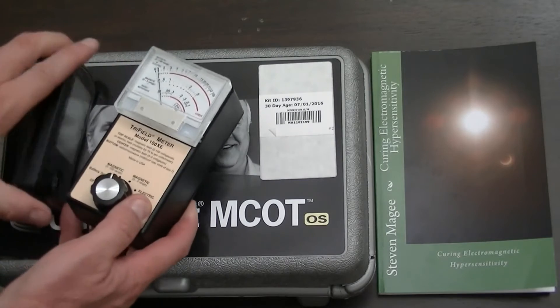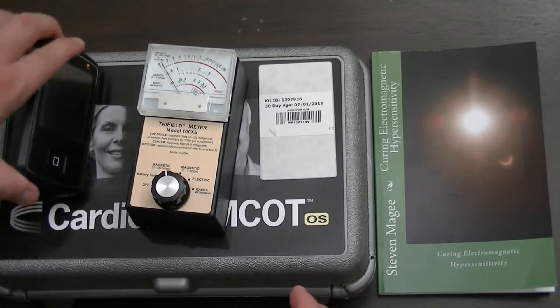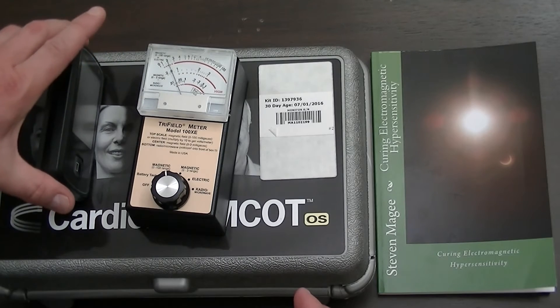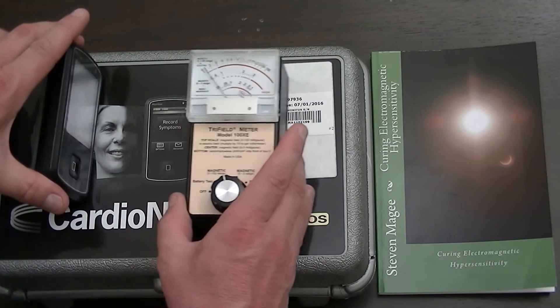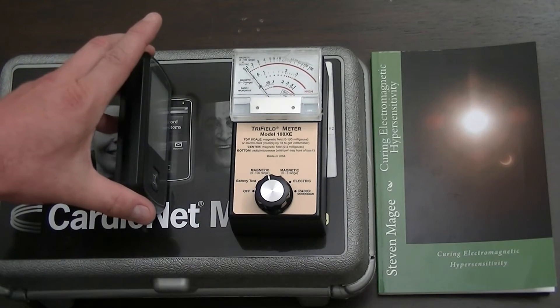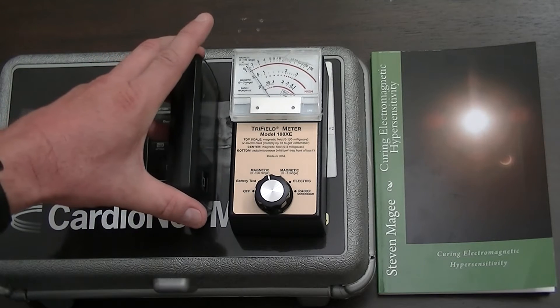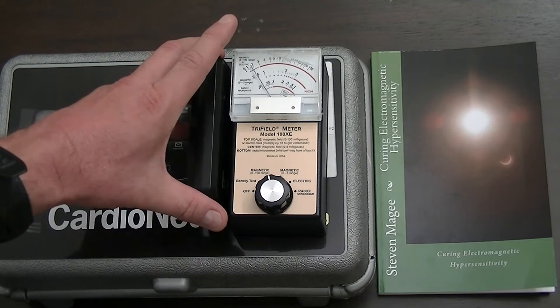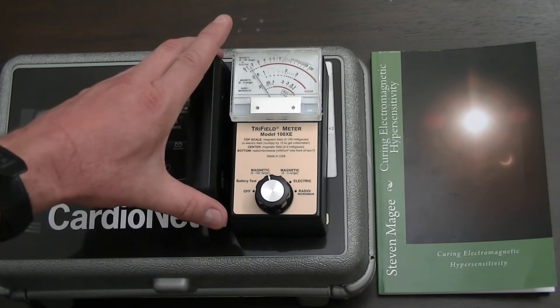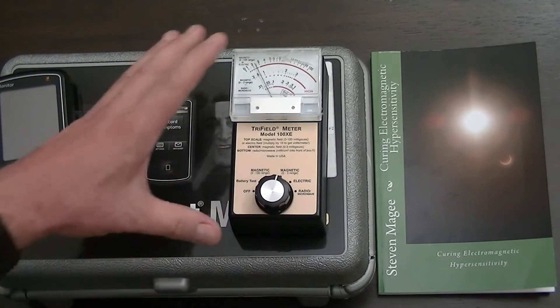Let me just put this on its side. The orientation can affect the meter reading, but you can see there's quite a bit of distance that this emission travels — as we get closer, the field emission gets stronger.